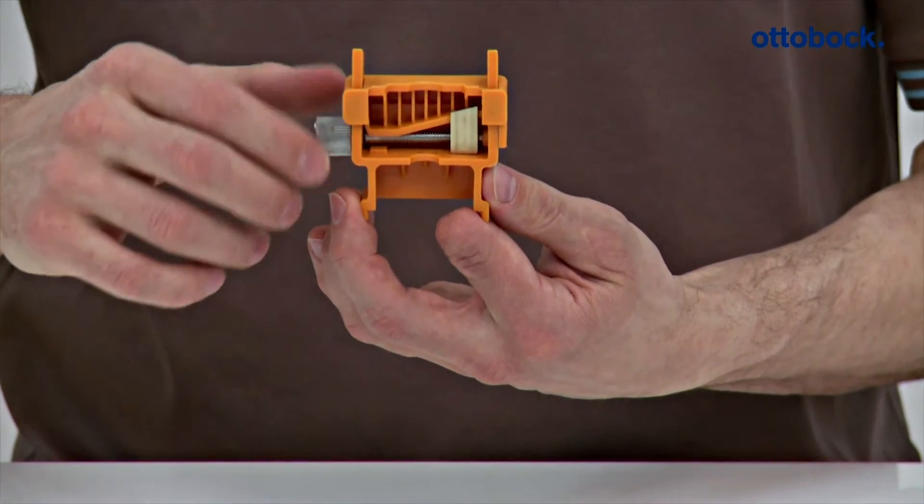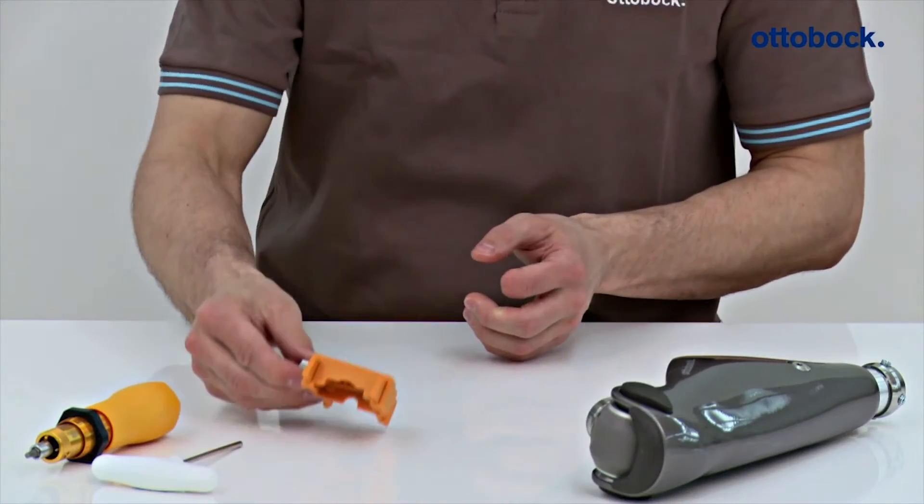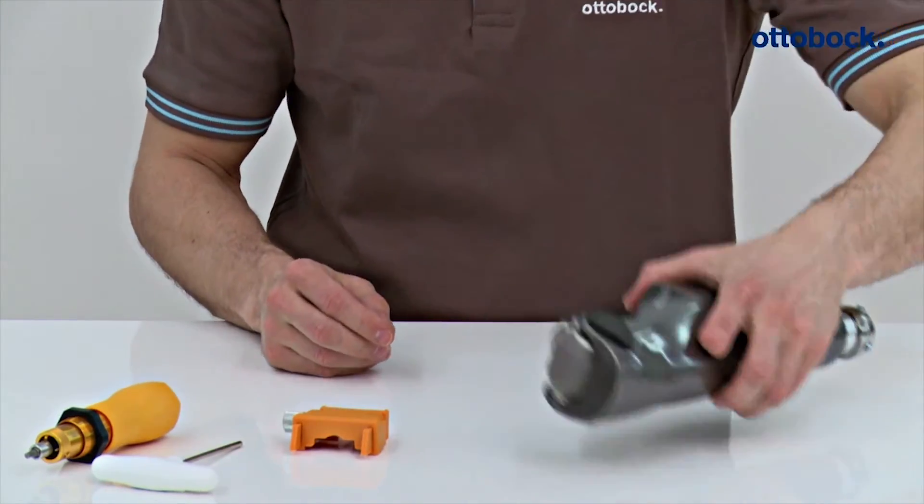Turn the adjustment screw of the knee extender counterclockwise, setting the knee extender to the minimum height. Then extend the knee joint.